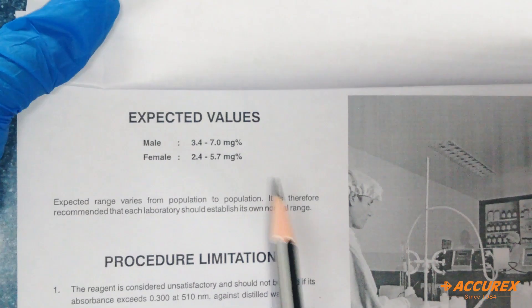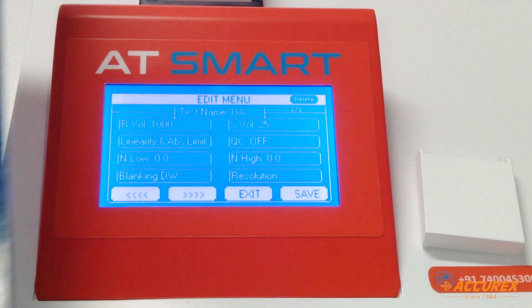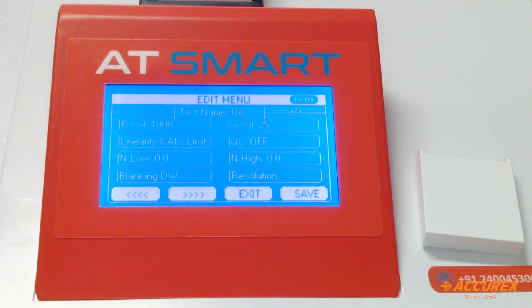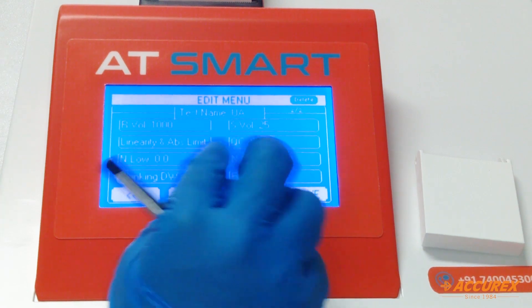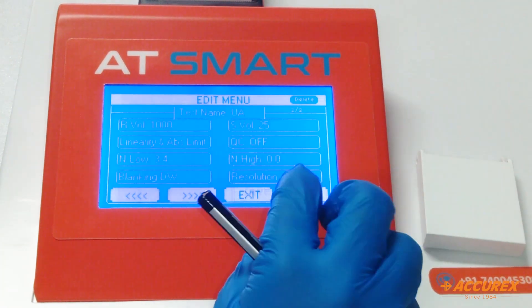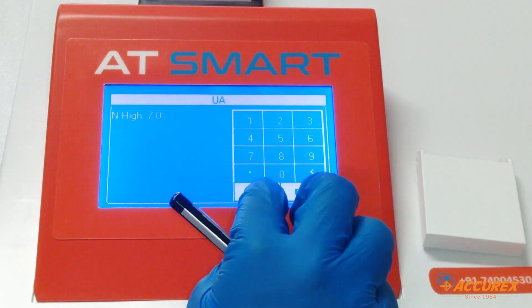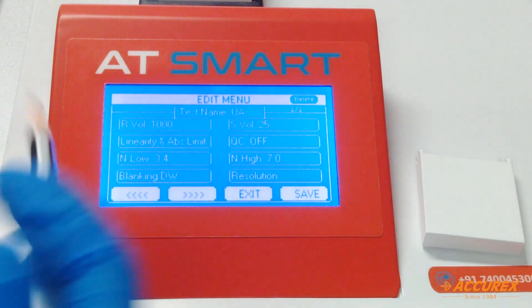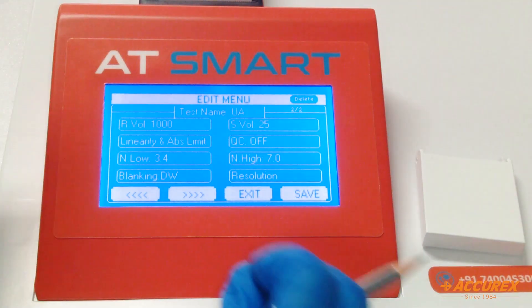Normal range: the normal range is 3.4 to 7.0 mg percent, so type 3.4 and 7.0. Blanking: the zero setting is with reagent blank, so select reagent and enter.